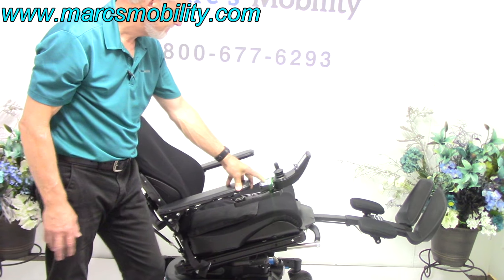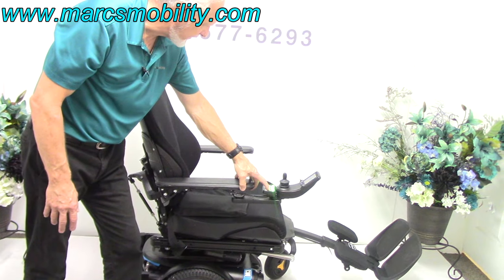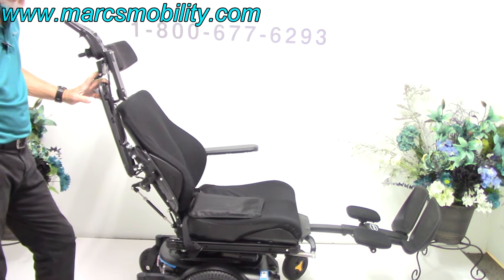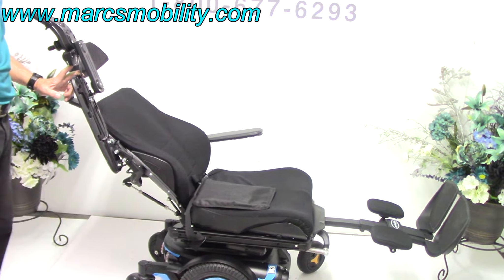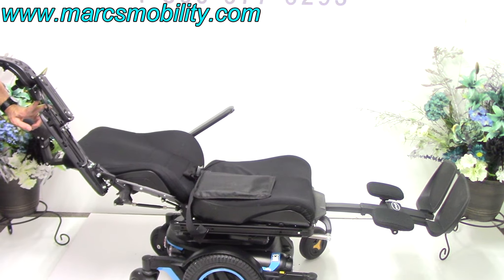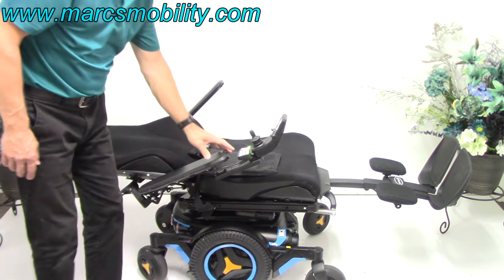I'm going to bring the tilt back down, and now I'll put the legs back up again. We're going to do what's called the electric recline. The electric recline is just the back going back by itself. If you're laying down in your chair at the end of the day, let's see how far back this one goes — you're pretty much flat. That's called the electric recline.